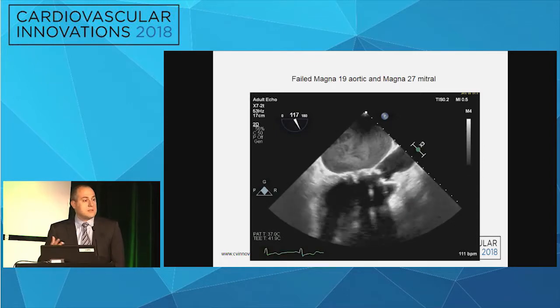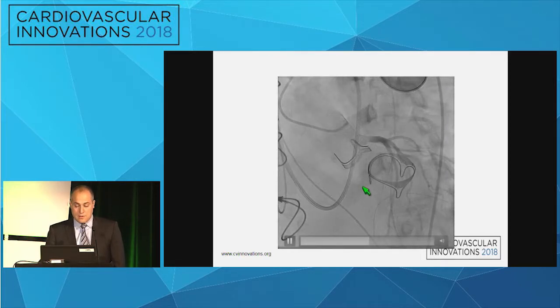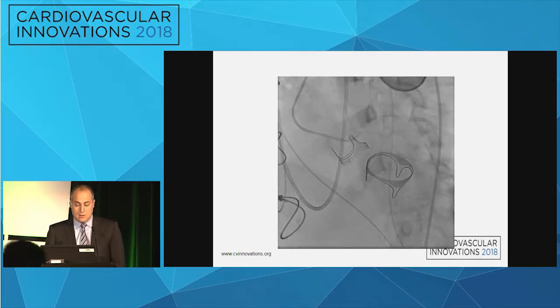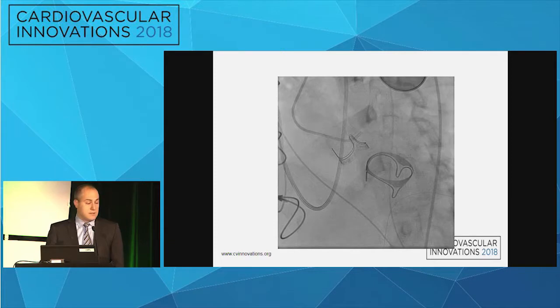So there is not enough time to do a full analysis, and she's also in renal failure, but one shot at least here during the case, and we need to improvise during the case, when we understand that she is high risk for coronary obstruction.